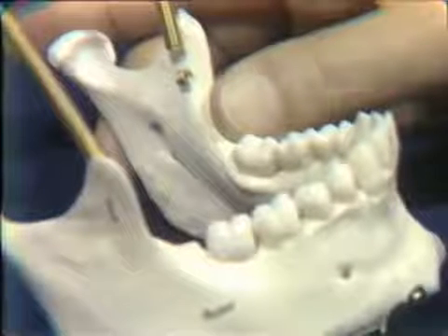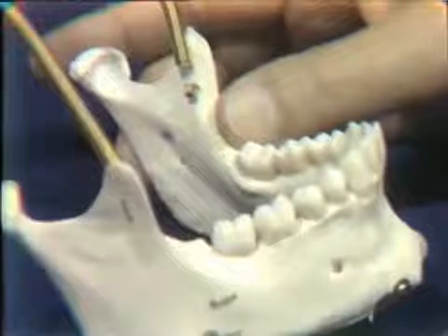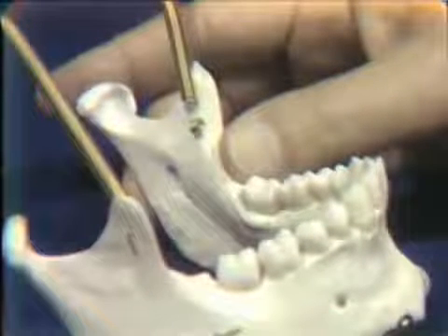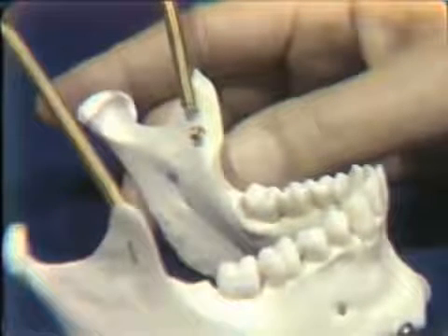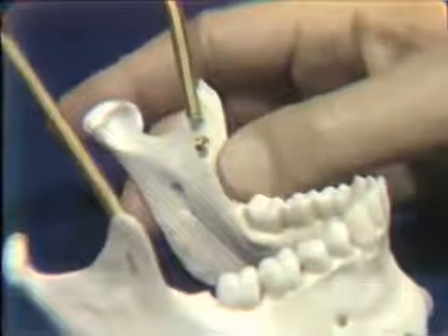And you can see my finger on the posterior border of the ascending ramus in a like position. We know that the mandibular foramen lies on this plane approximately 2/3 the distance from the anterior border to the posterior border. As we make the approach with the syringe, we also at the same time have palpated the internal oblique line, so we know where it is.